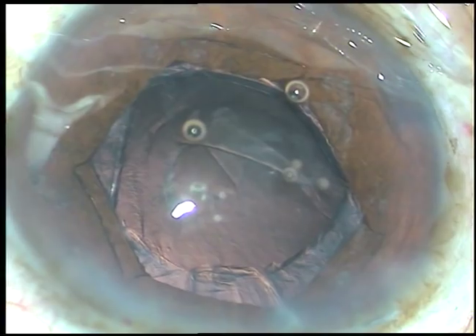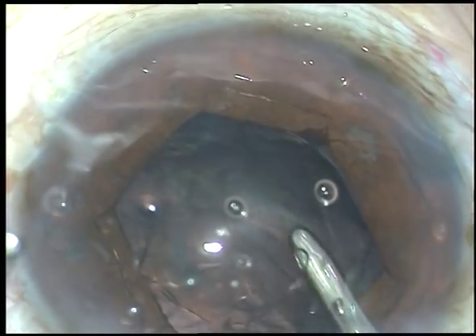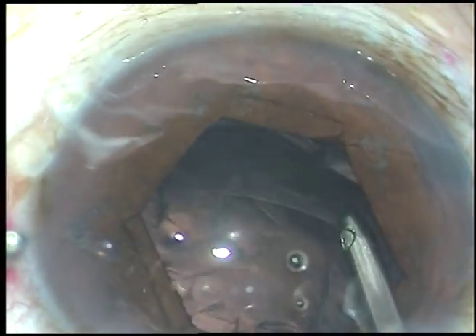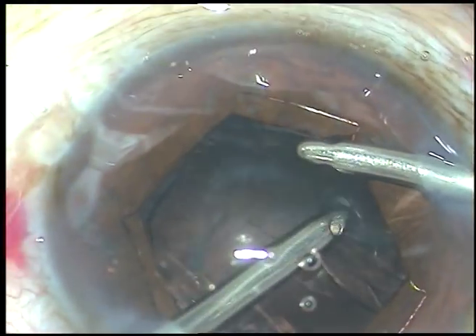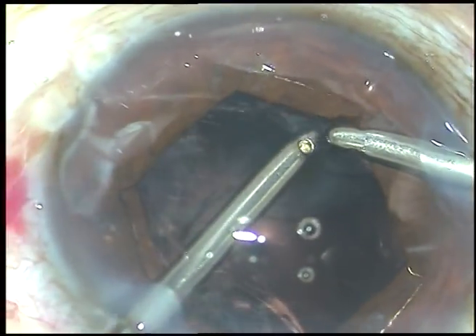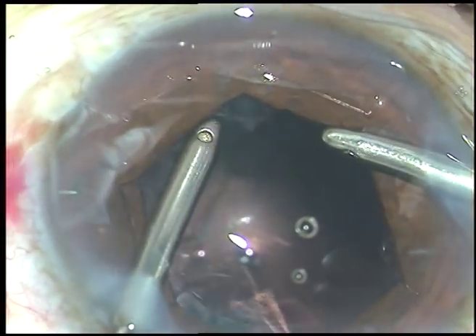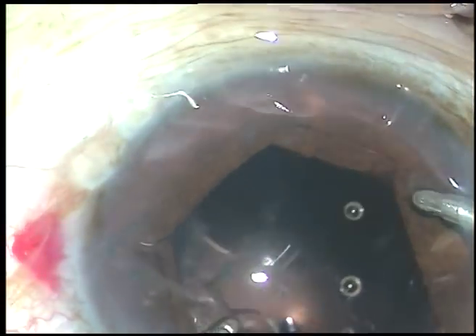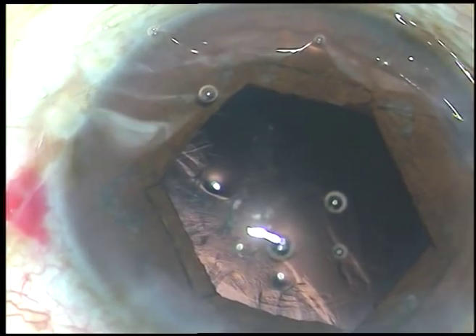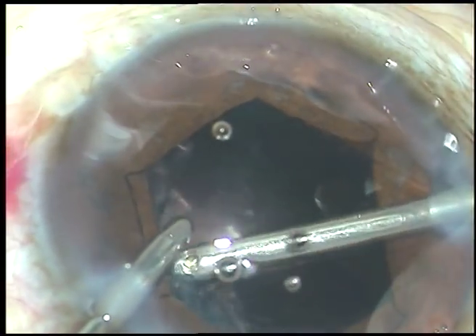Viscoelastic substance has been injected into the anterior chamber. Now I am taking the bimanual irrigation aspiration — doing some hydrodissection actually, and now removing the cortical matter. The irrigation is through the right side port and aspiration through the left. Now I change hands — irrigation from the left and aspiration from the right.